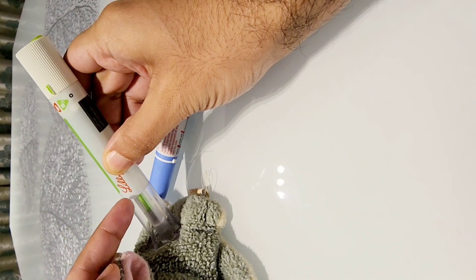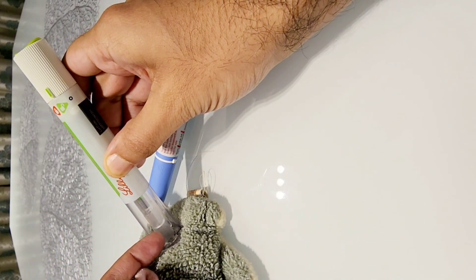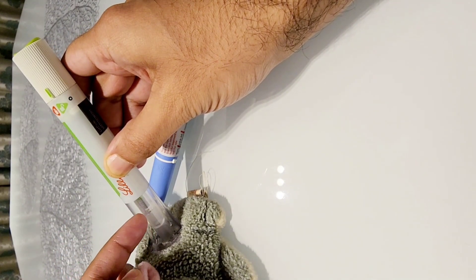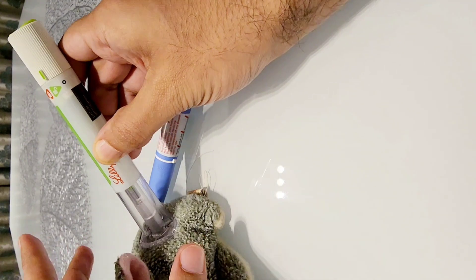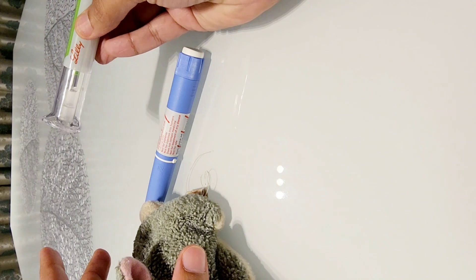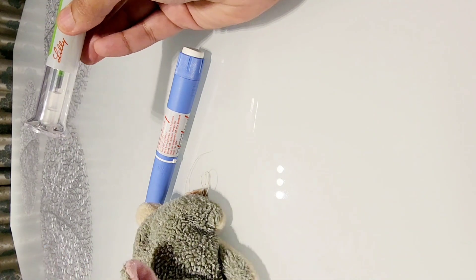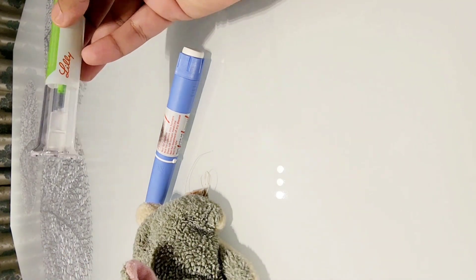So what you would see here is a piston coming down and it returns back. So you have two clicks. The first click means the needle went in. The second click means the needle is back out and you can just remove it and throw away the pen device. It means the full dose has been administered.